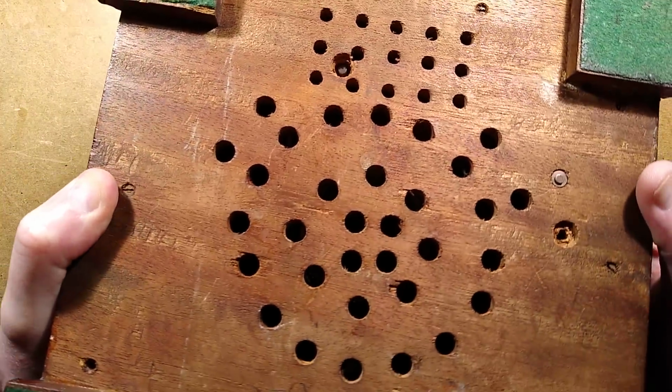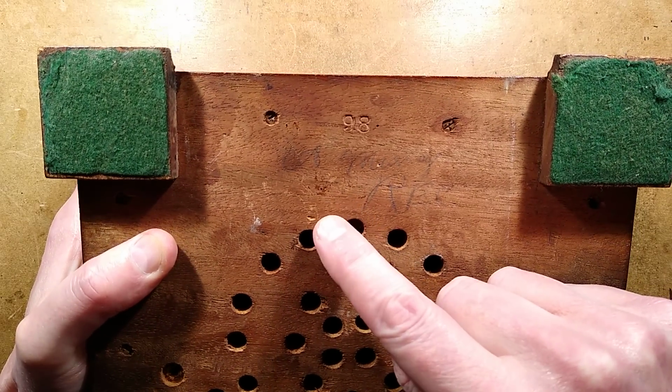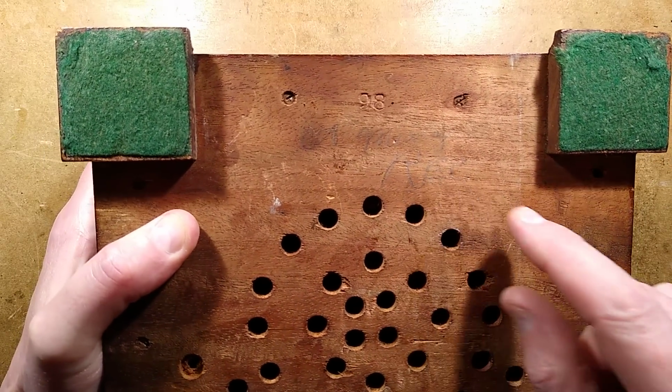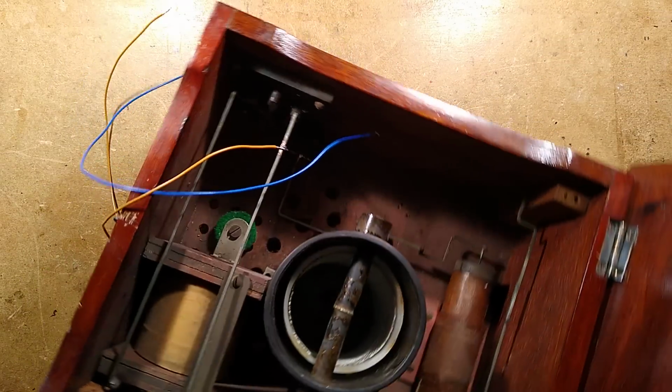Is that 86 or 98? There's text here. Oh, I'm not sure what that says. Is the person who made it, have they signed it? Oh, I may try and decipher that later on. That is quite odd. Anyway, let's take a look at the inside, because that's the bit we're interested in.